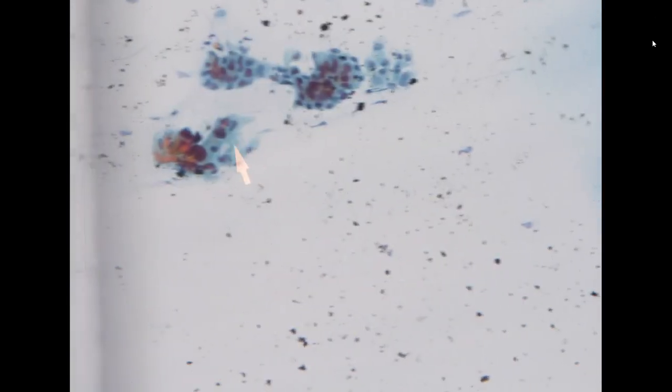So this is a very good cell for ASC-H, okay? We should not see these as an aging change. These are not aging change. So here as well, this looks very suspicious for HSIL. Okay. So we call this ASC-H.